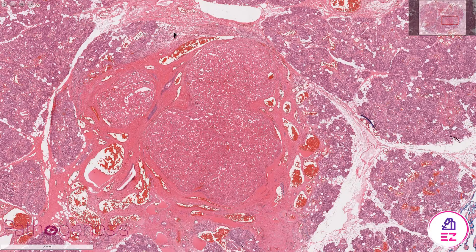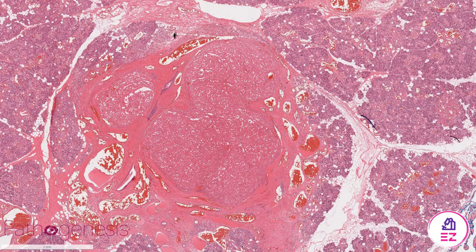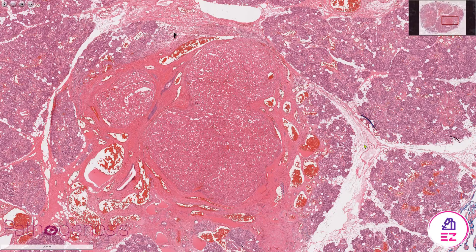Hello and welcome to Path Made Easy. Today's example is an oncocytoma occurring in the parotid gland.